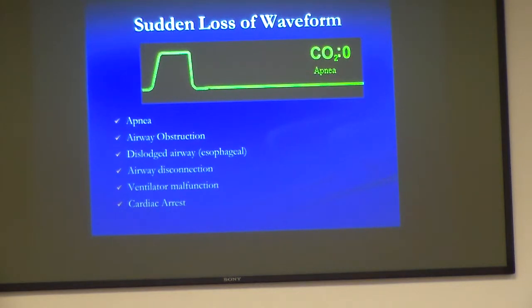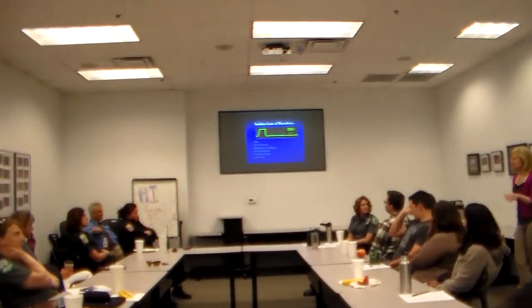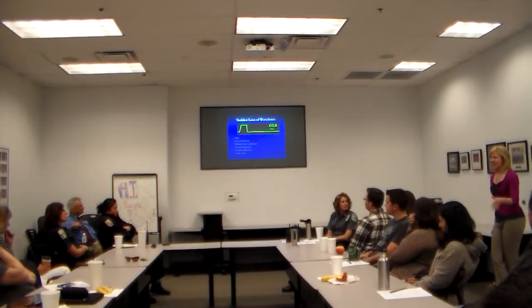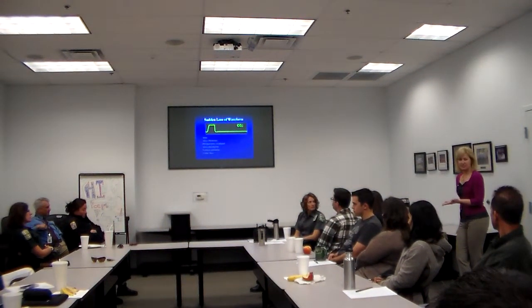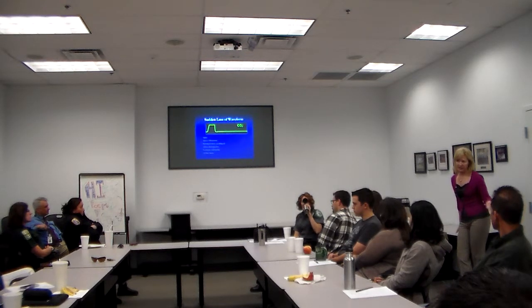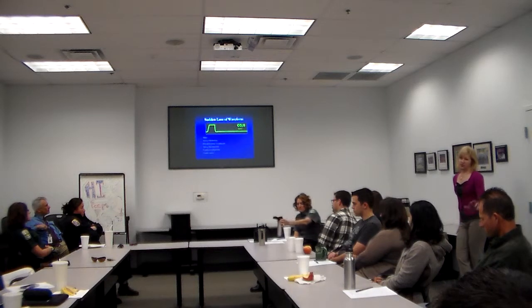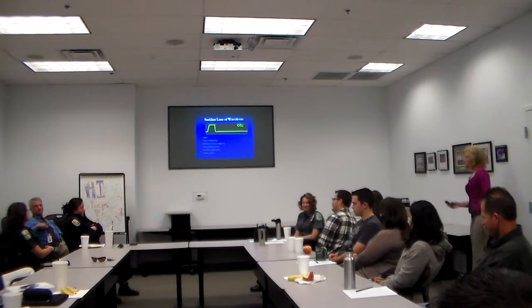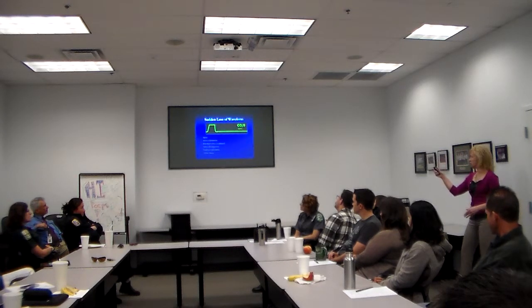So anyway, it was just a clear example of how quickly your end-tidal CO2 goes to zero and your pulse oximetry continues to look fine. If I had just been basing this off my pulse oximetry, I would have really been in a bad place when I got him into the ambulance, because by then I would have been a couple minutes behind in what I should be doing. So we fixed the problem and the patient did just fine, if you wanted to know, on their way to Sierra Vista. But if you see that, you better check real quickly.